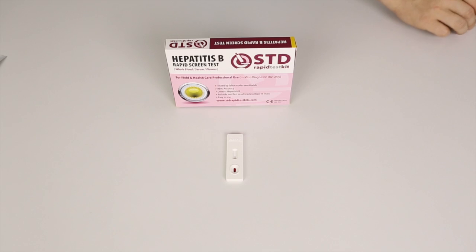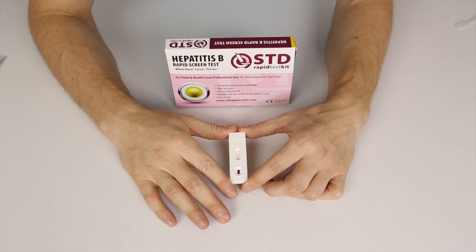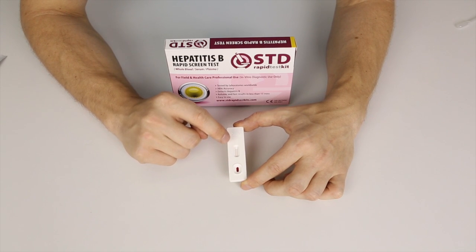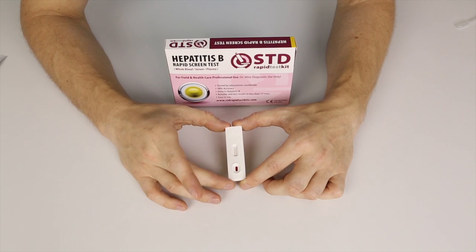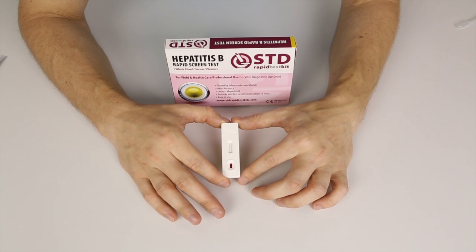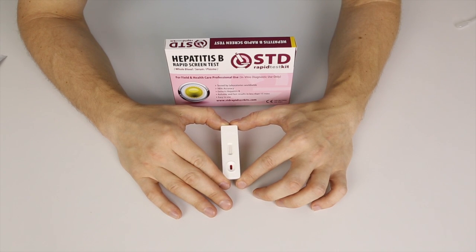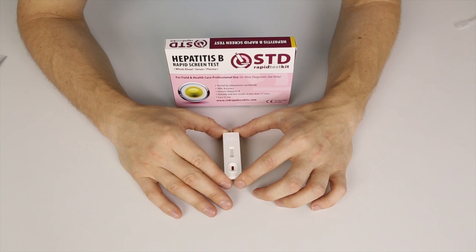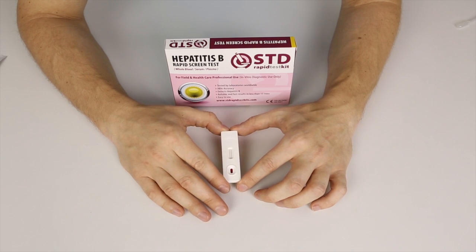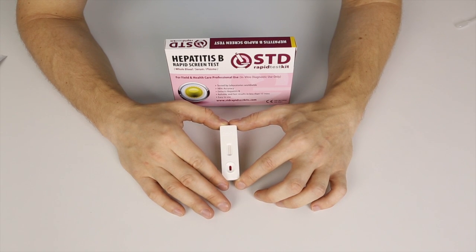Just wait for the result. Here on the test cassette, first of all you have the sample well. You also have the letter C and then there's the T. The C stands for the control line, while the T stands for the test line. As long as the control line shows up, that means you have a working test. If it's a negative result, only the control line will show up — it tells you the test works and that you have a negative result. If a line shows up next to the T as well as next to the C, that means you have a positive result for Hepatitis B.